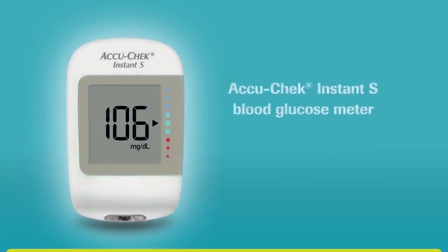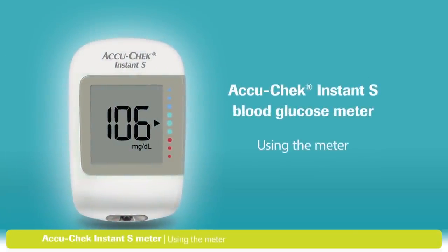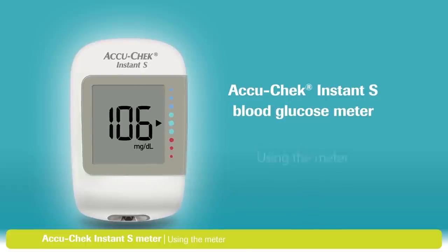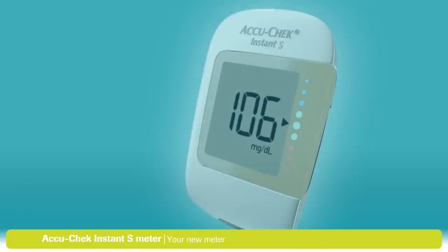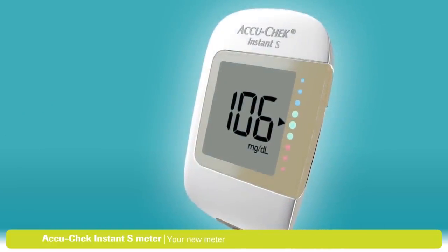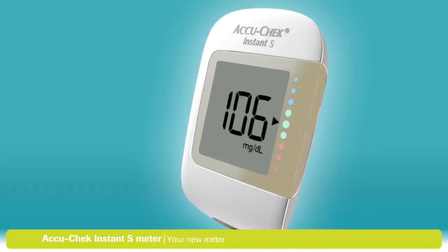In this video, we'll walk you through using your AccuCheck Instant S blood glucose meter. Now if you're worried about learning the steps involved, don't be. This video is divided into small sections, so if you miss anything, you can always go back and watch that part again.